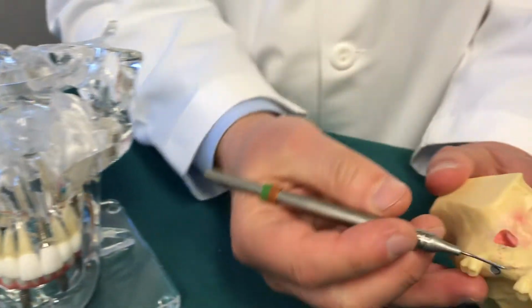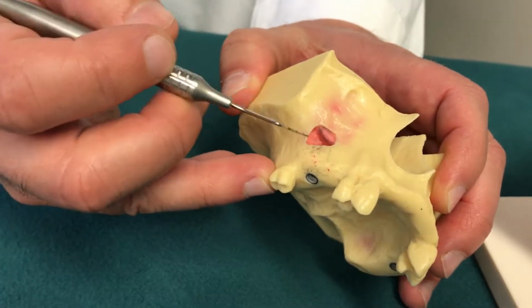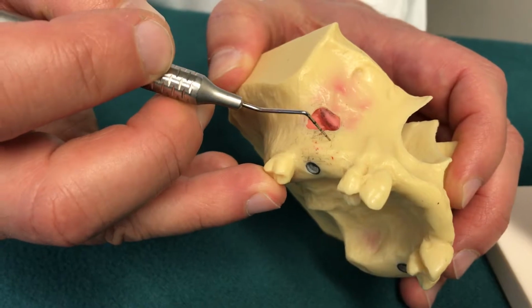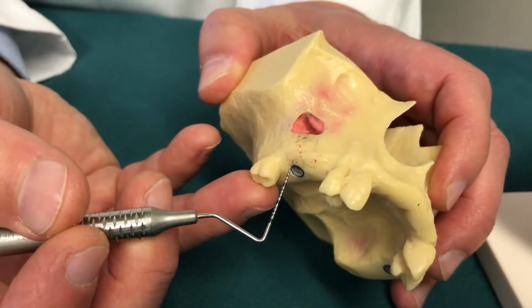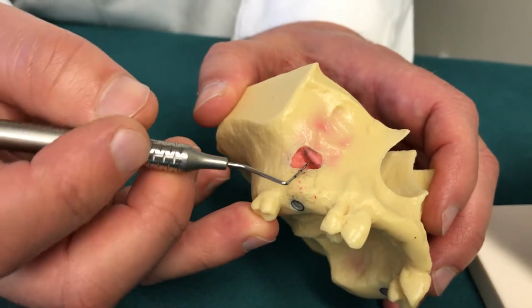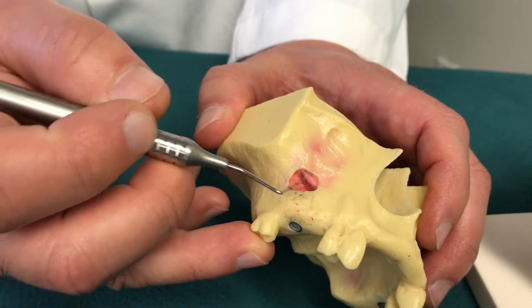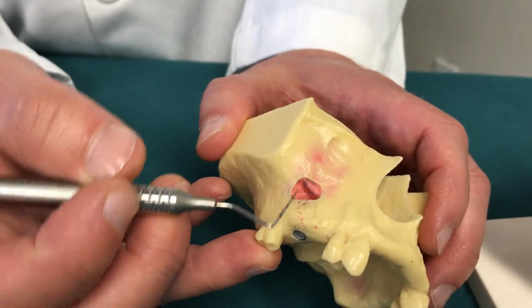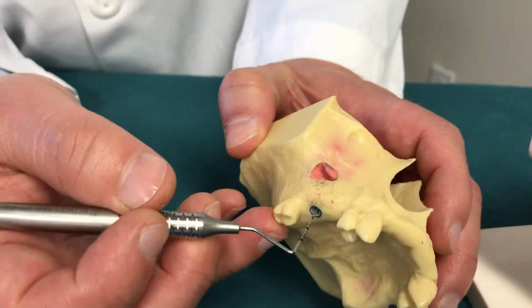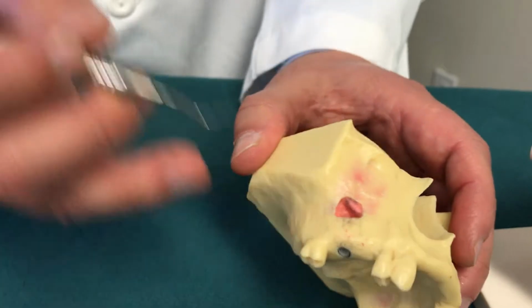Now, the other method of doing this is that we go in there, but we don't go to the side of the jaw. We put a hole right through to the floor of the sinus, and then we push that up with a certain type of specialized instrument, and push the membrane up, and then I create the same amount of space in there to have the implant within the bone. That's called the crestal approach to do this procedure.